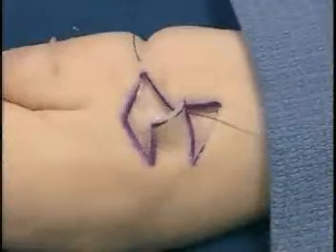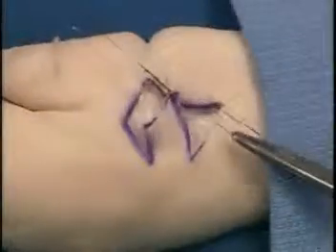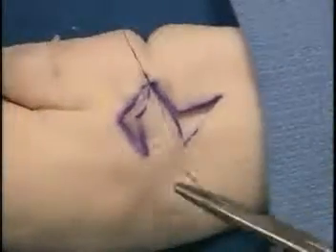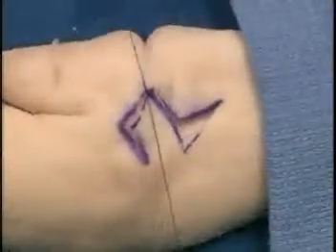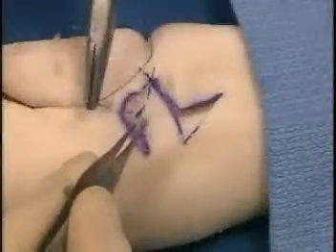All apices of the flap are then sewn. Here's the first suture at the point of maximal tension. It is at a corner. A corner stitch is not necessarily needed in every case, but you can see how nicely this flap is rotated into position to cover a defect.